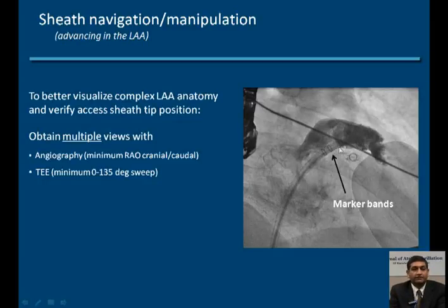Now we look at the safety results in this study. As with any device versus drug comparison, there is a higher upfront acute risk of complications associated with the procedure.